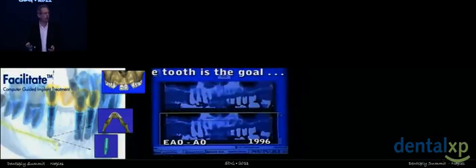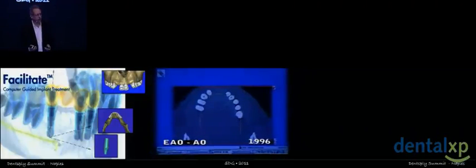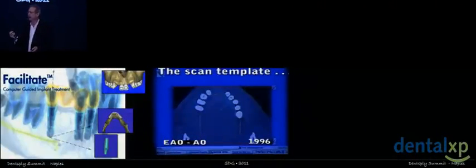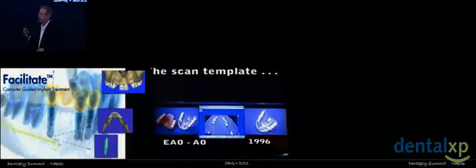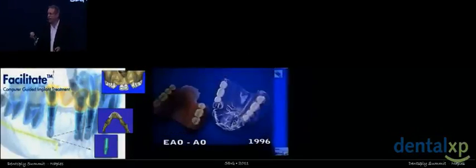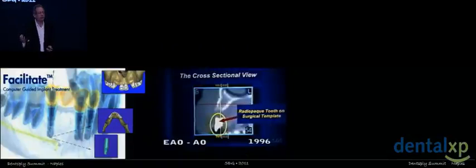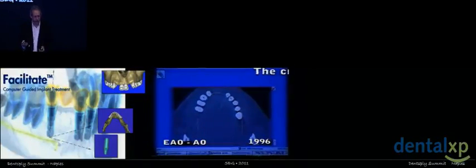And Marcus Abud talked very nicely about some of those concepts. And here I am 15 years ago talking about the use of a radiopaque template to understand the relationship of the tooth to the underlying bone. This is a template that needs to be made before the scalpel touches the patient, before we take the scan. And of course, this was before we had cone beam CT. This was with regular CT technology.